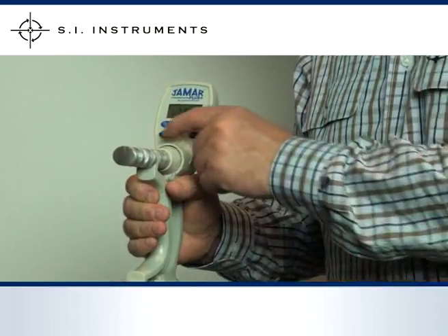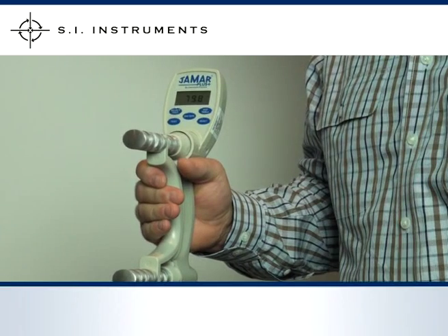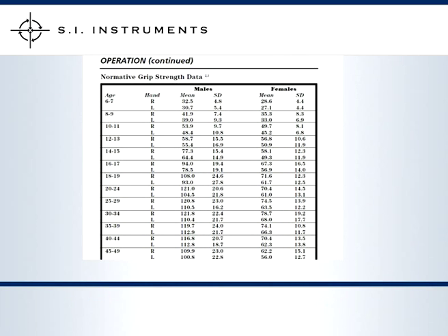Once all tests have been completed, cycle through the results using the TEST key once more. Both the Jamar Hydraulic Hand Dynamometer and the Jamar Plus come with operating manuals which include helpful normative grip strength data tables.